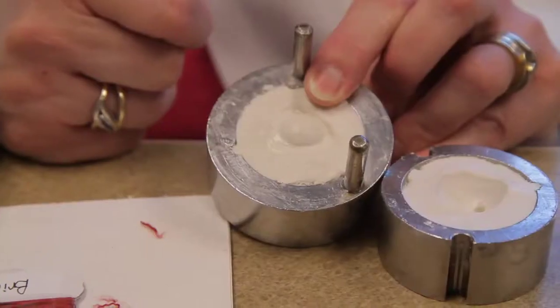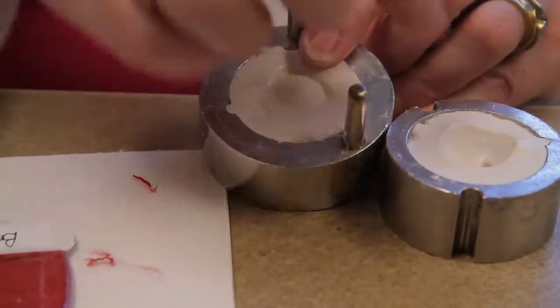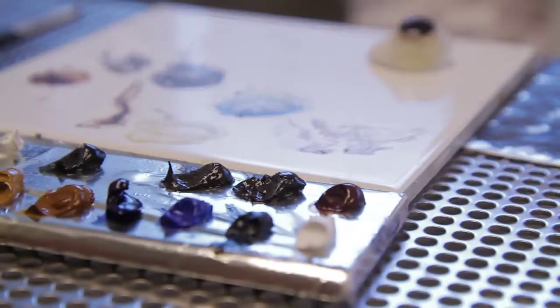I take an impression to fit the eye. The impression is taken much like you would take if you're making a mouth guard for somebody. I use a tray, create the shape from the impression, and then do all the artwork.